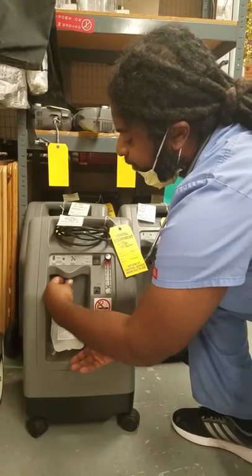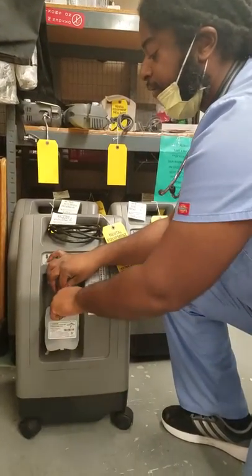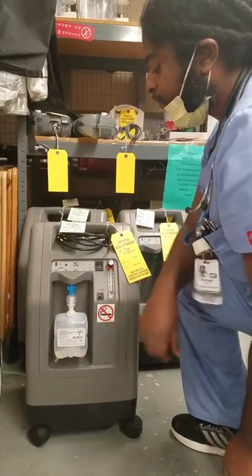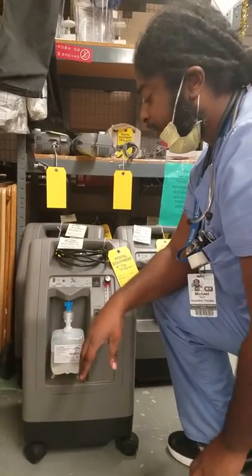Twist and tap this on until it's snug, then hook your oxygen line right into that nipple. It should bubble when you turn on the concentrator, to confirm there's good flow coming through. Check your sats and you're good to go.